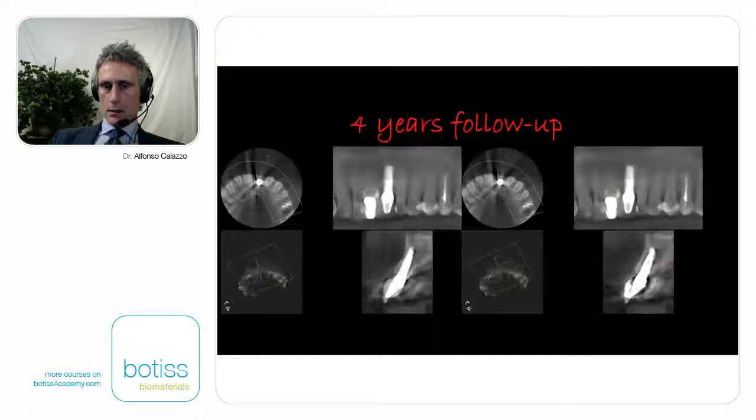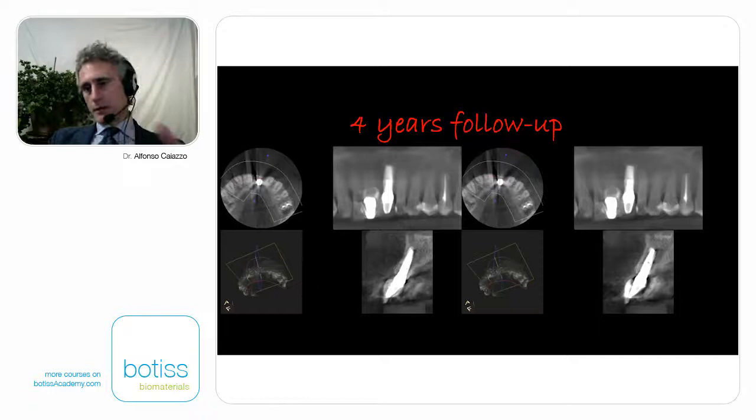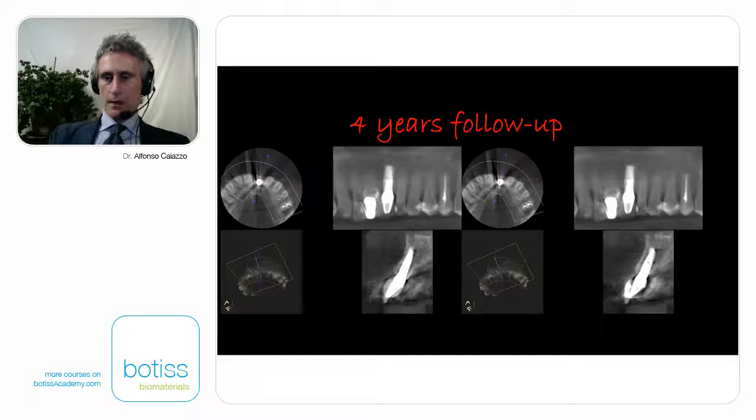And of course I take CBCT. I can't say that it's stable and the graft is still there if I don't show any CBCT in the long term. I have a 4 years follow-up CBCT and even more on my patients. And the graft is still there. Buccal plate preservation, the graft on the buccal plate here, some at the collar, and it's been 4 years. So I know it's stable. The graft will be there forever. Because I know that, it maintains the volume in the long term.